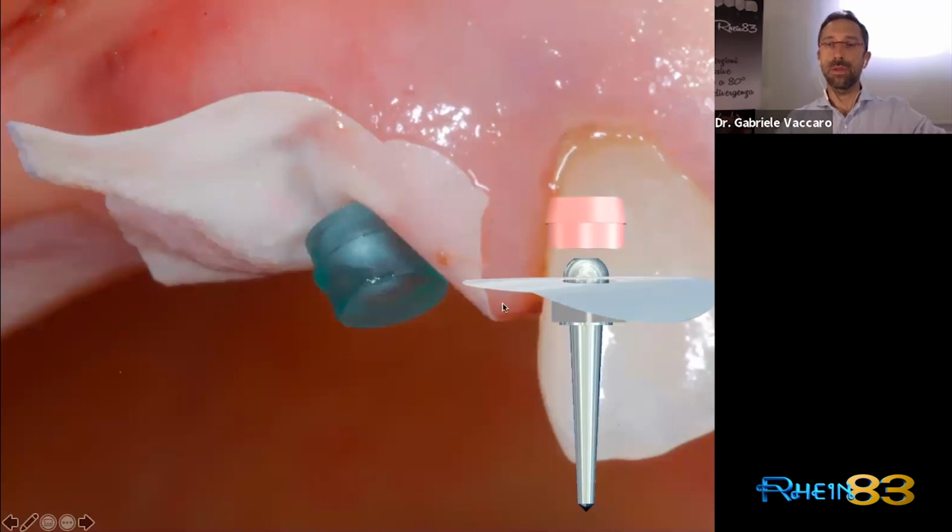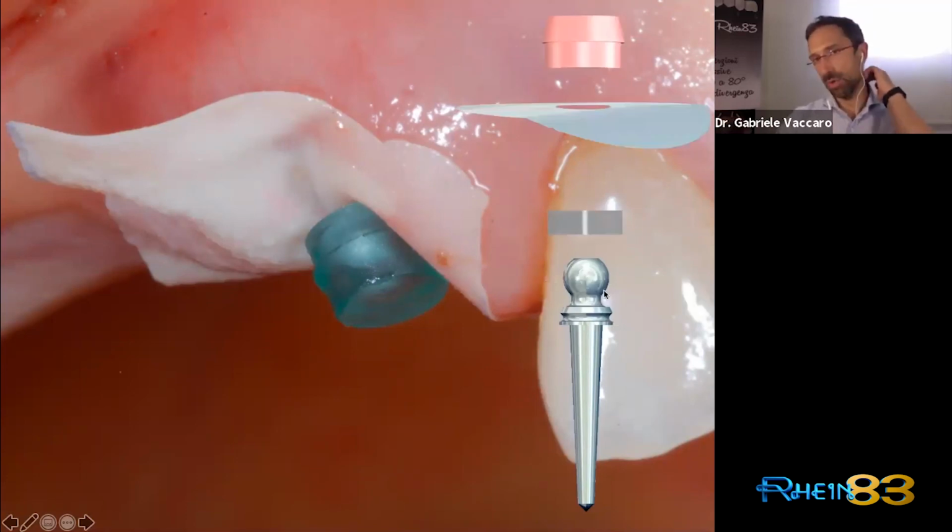First of all, as you saw in this animation, I'll show you again: put a centering ring if you notice that the female cap oscillates a lot over the sphere block.